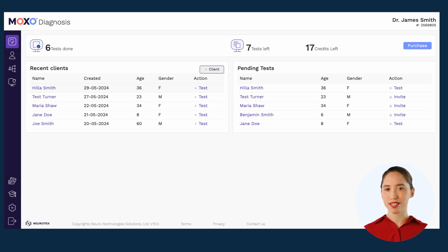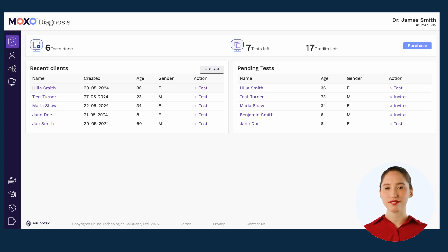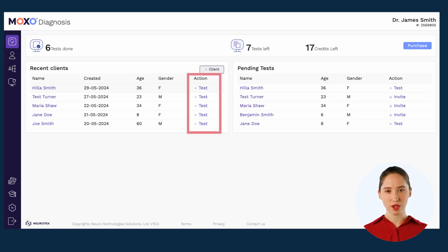There are two ways to assign a new test. The first way is directly from your dashboard page by clicking the plus test button next to your patient's name.